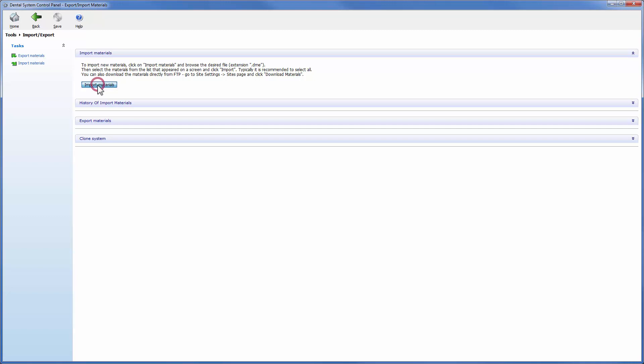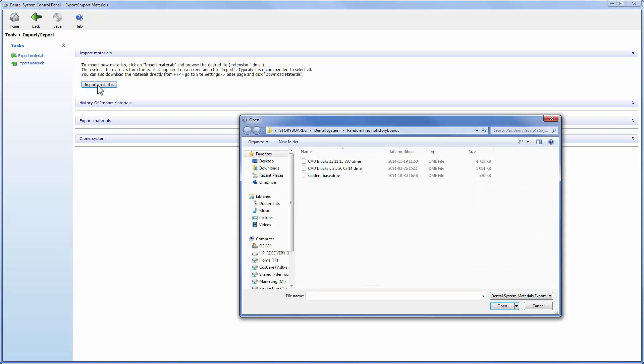Click on the import materials button to proceed with the import. A Windows browser will open and allow you to browse to the folder with the DME file. The import of multiple DME files is now supported. Select the desired material file.